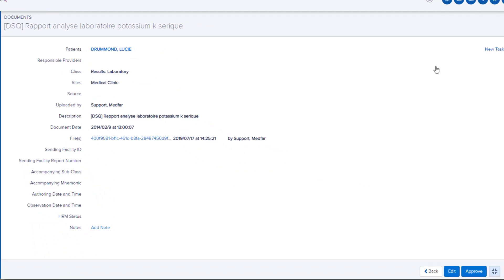As long as the document has not been approved, you can modify these details by clicking here.